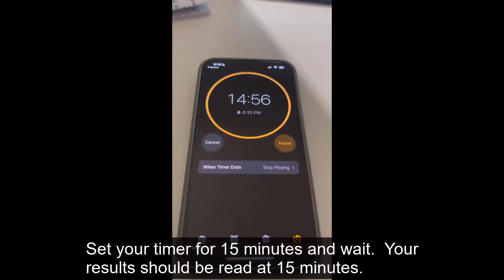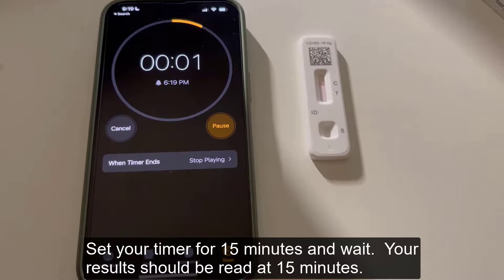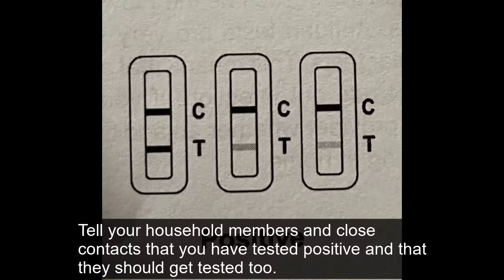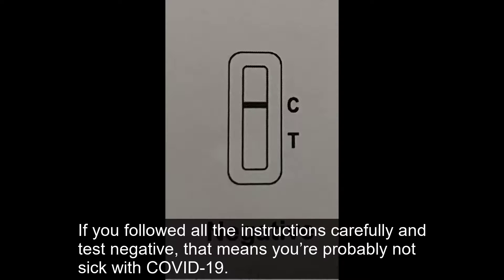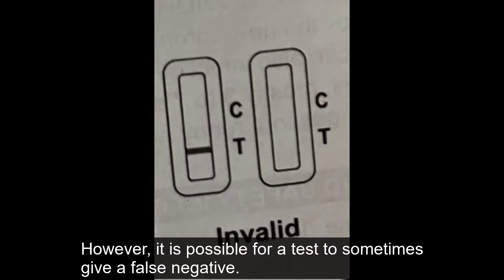Step 5: Results. Set your timer for 15 minutes and wait. Your results should be read at 15 minutes. Read your test results in the test cassette window. If your test is positive, isolate at home away from other people for 10 days. Tell your household members and close contacts that you have tested positive and that they should get tested too. Talk to a healthcare provider to help you determine next steps and answer any questions. If you followed all the instructions carefully and test negative, that means you're probably not sick with COVID-19. However, it is possible for a test to sometimes give a false negative.